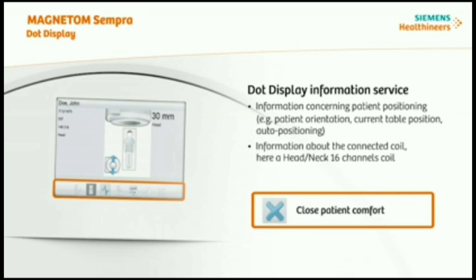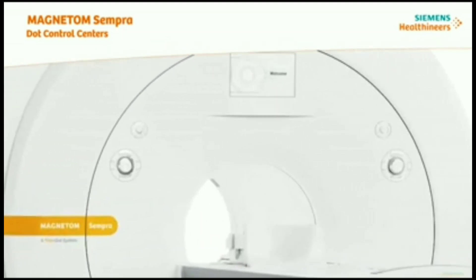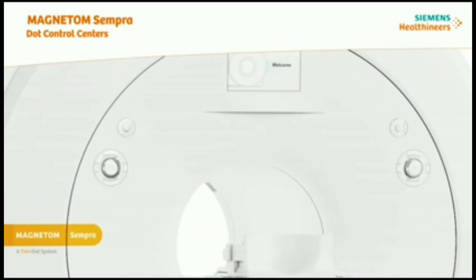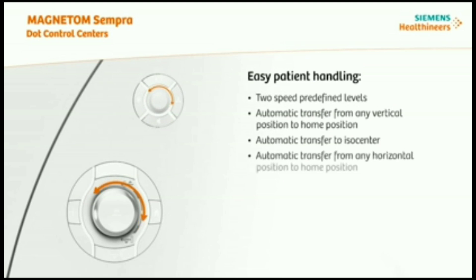At Magnetom Sempra, you will also find the DOT control centers. These are ergonomically designed and integrated into the front cover on the left side of the patient tunnel. DOT control centers support you in easy patient handling. You can navigate on the DOT display to choose the right functionality, including functions like two-speed predefined levels, automatic transfer to isocenter, and start scan.